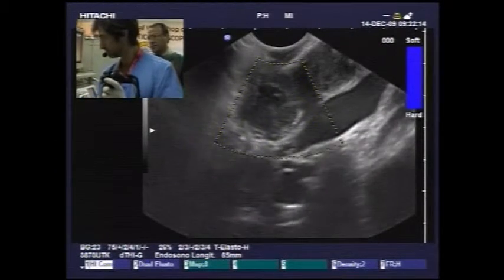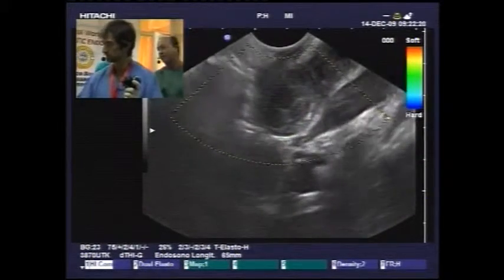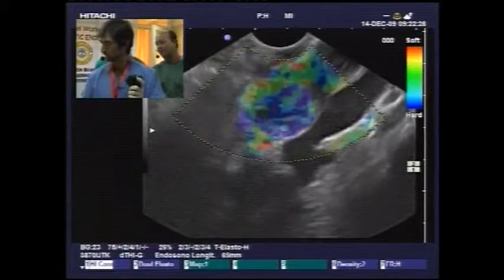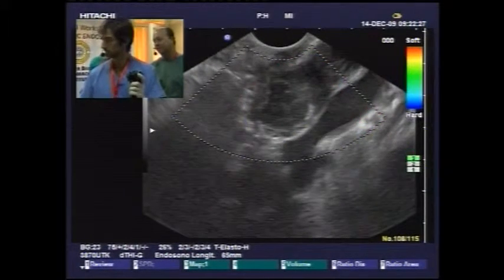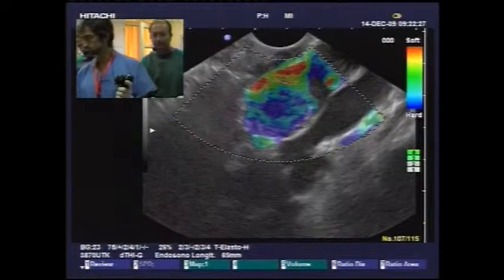We found in our experience in our center that the positive predictive value of using the echo characteristics is very poor. Yeah, I agree. Predicting, distinguishing between TB and lymphoma and sarcoidosis. We have a lot of sarcoidosis as well. And there's very poor correlation between the echo characteristics. Is your experience different? Can you predict what the cytology is going to be like?